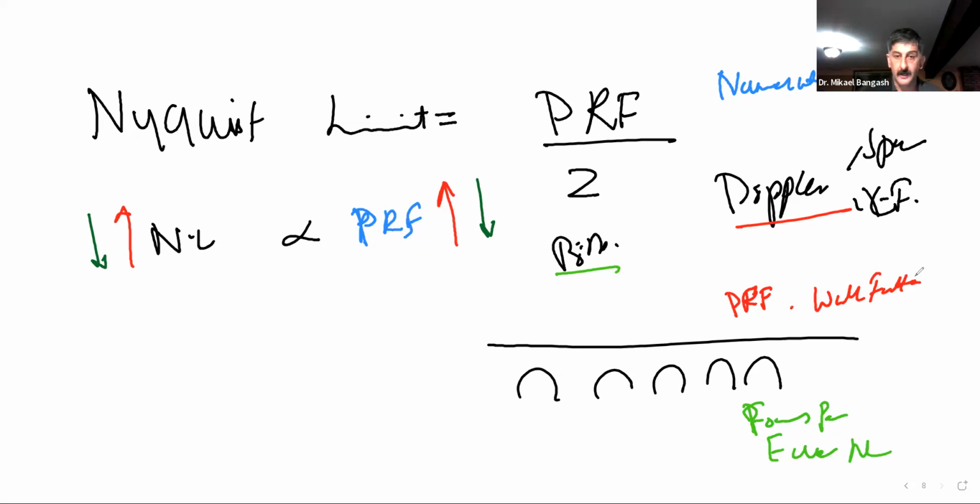So the first knob on your right side of these 5 knobs, right next to the touch screen, when we turn on Doppler, has 2 functions, which are the PRF and the wall filter.